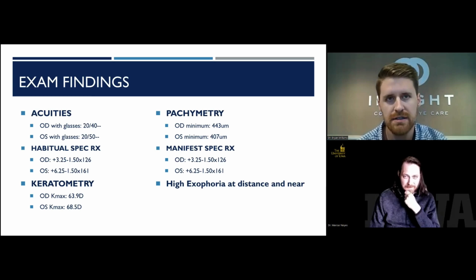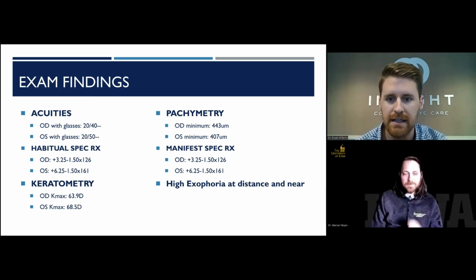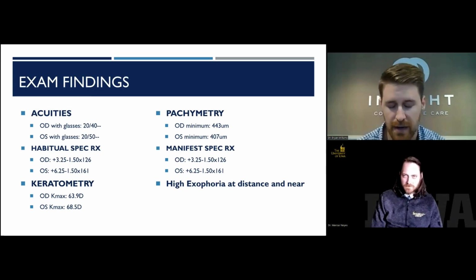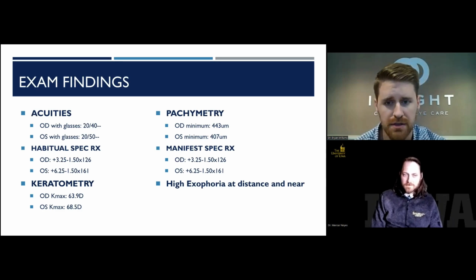So glasses, albeit somewhat needed for her binocular vision component, definitely weren't providing her much functional vision with the amount of prescription that you'd have to dial into that. If you can imagine putting some prism with that as well, really thick glasses that we'd be dealing with. So contacts, great option for this patient. You can see her keratometry and pachymetry readings there. Very thin cornea post-surgical.